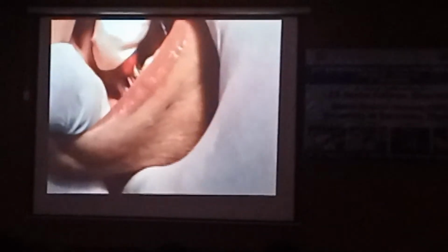So what I have done is I have placed the abutments, okay, the impression posts. But see, I am not very happy with their seating. Okay, now they are seated.